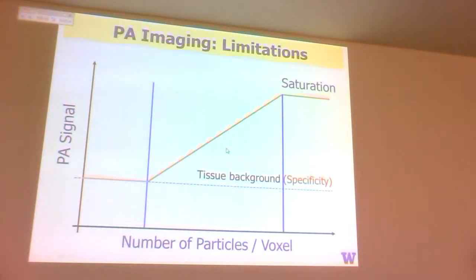But we also have another one, and usually this one dominates, certainly for in vivo photoacoustic imaging, and that is the tissue background. Namely, I'll have an offset in this signal. I have photoacoustic signal that's happening there. And for photoacoustics, what do you think our bad guy is? Like I said, for typical labeled fluorescence imaging it's autofluorescence. Who's our bad guy here? Blood. Sorry for the acoustic noise there. Blood's everywhere. Blood's efficient, right? If you pick the wrong wavelength, blood can dominate everything.